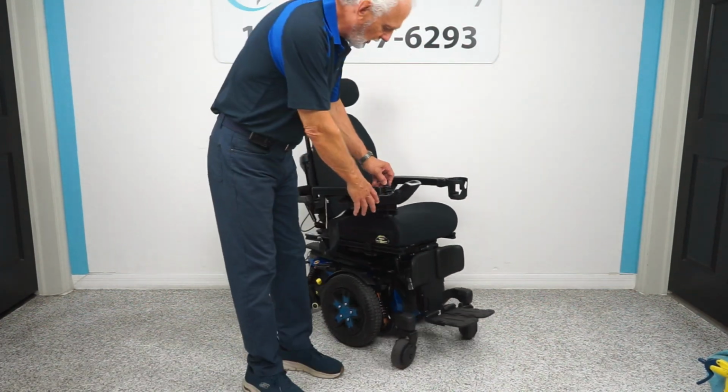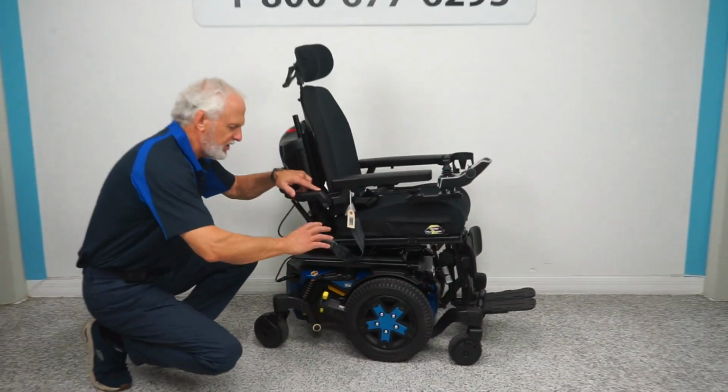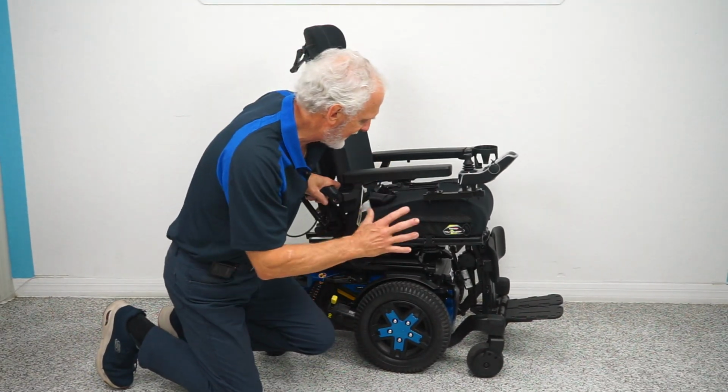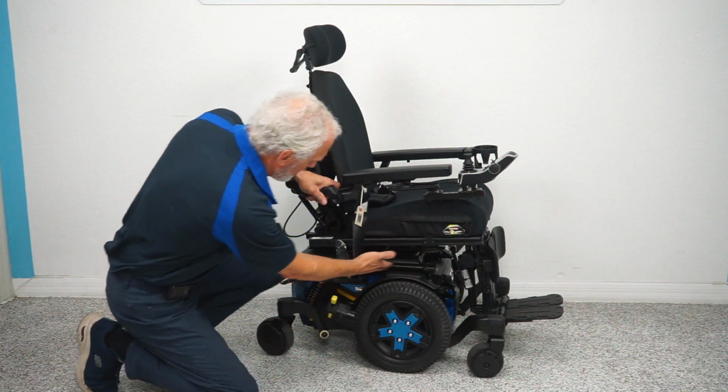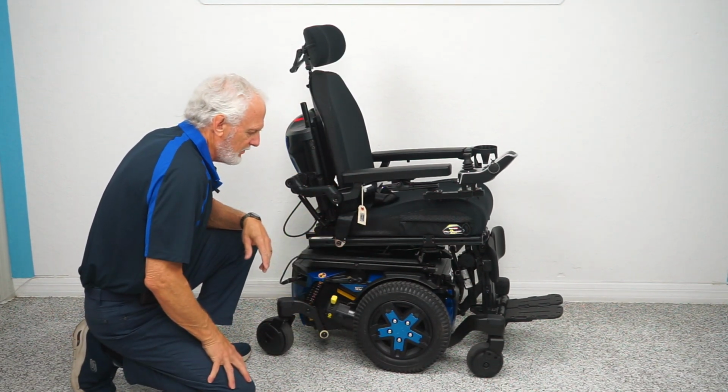So this is a Total Comfort power chair. This is called a rehab chair. This chair, folks, weighs probably 375 pounds. Really heavy. There's a lot of metal in the seat, a lot of metal in the frame. It's very well constructed. This is your high-end power chair.